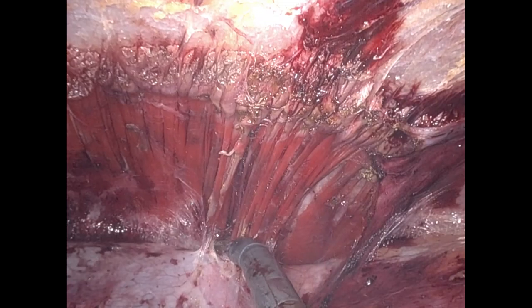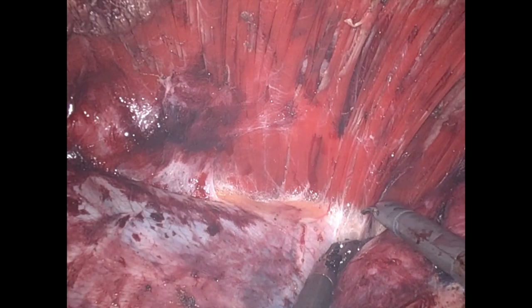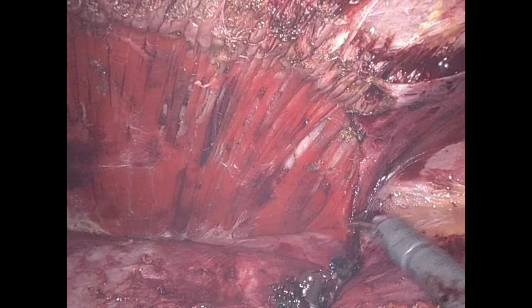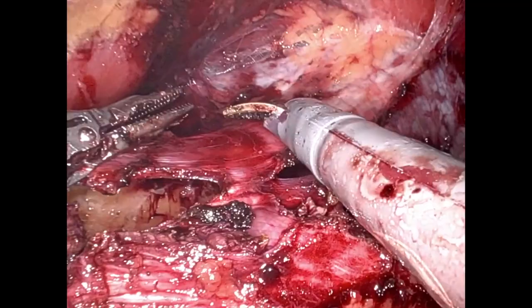Classic TAR flap here — you're seeing us extend this dissection until we see the yellow of the retroperitoneal fat. That's usually a good landmark for at least a relatively adequate transversus abdominis release. You can always go much more if you need to, but at a minimum you want to see that.